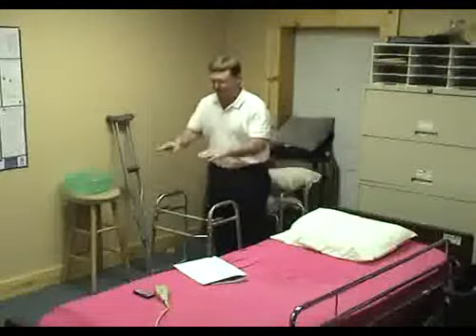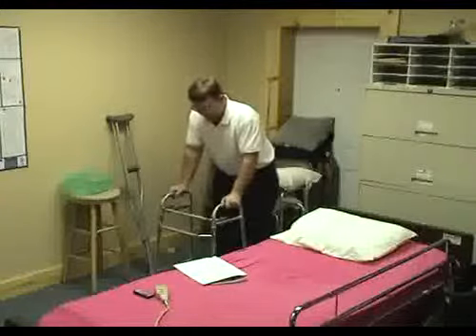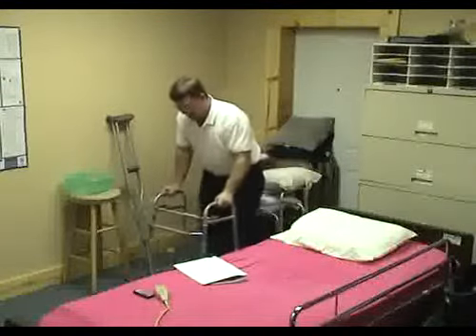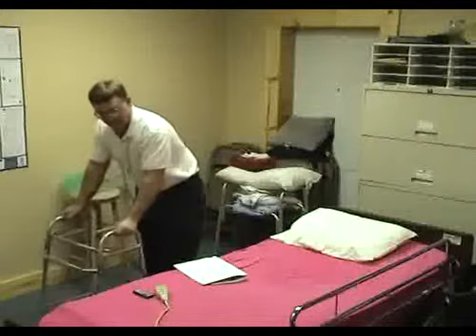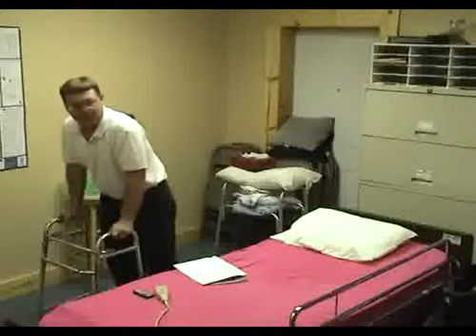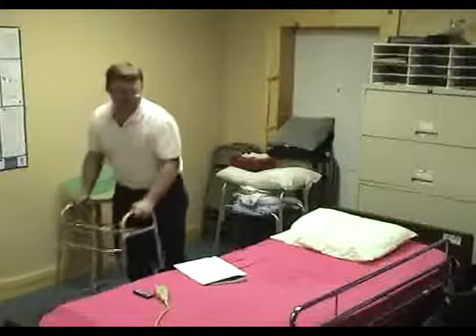And when you're going over some bumps, like thresholds in between doorways from tile to carpeting, the back of it goes over those little bumps easily. They can just push it along and they can walk. That way, if their knee gives out, they've already got something that's going to give them a nice, firm, stable hold.